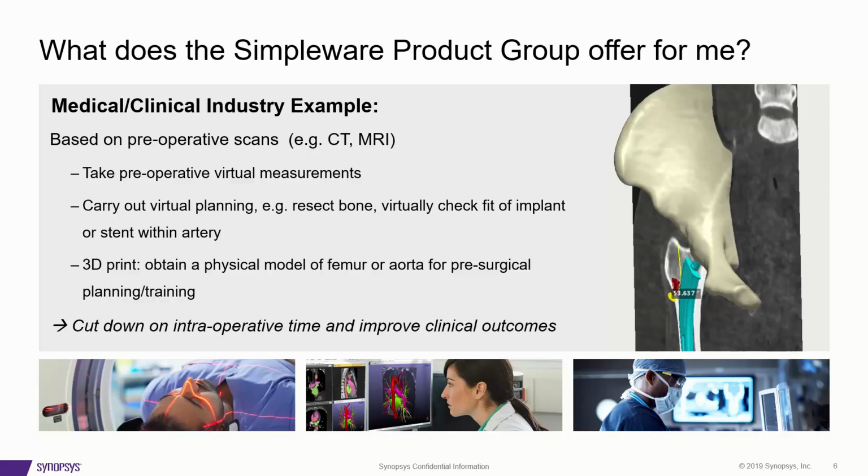So really, there are a variety of different applications here. There's the cutting down of intraoperative time and improving clinical outcomes, but there's also the training side and the education of patients into the procedures that they will be undergoing.